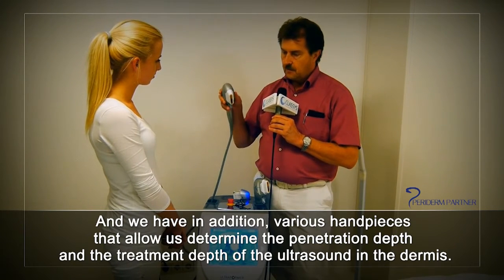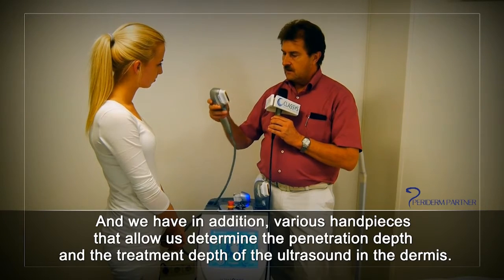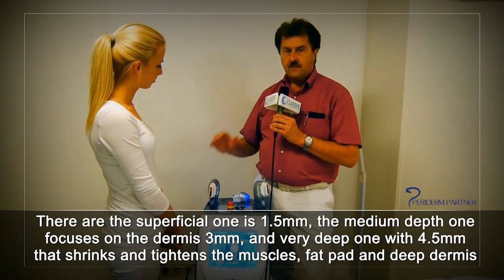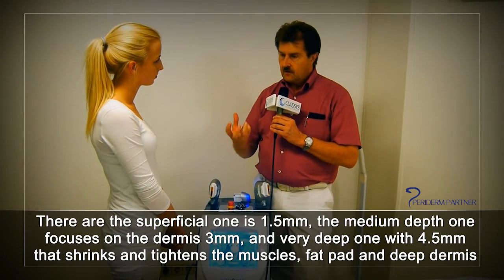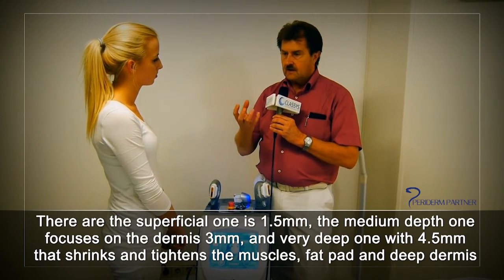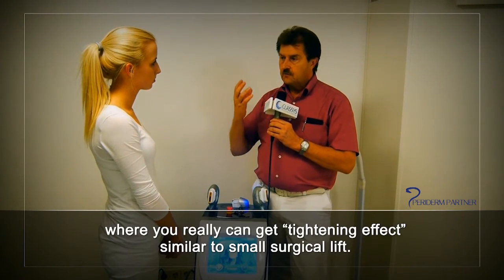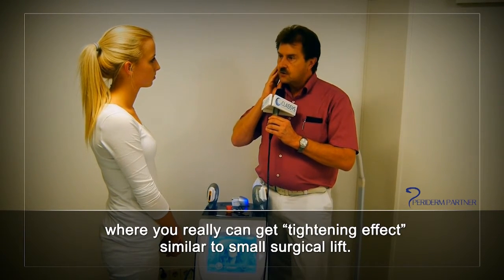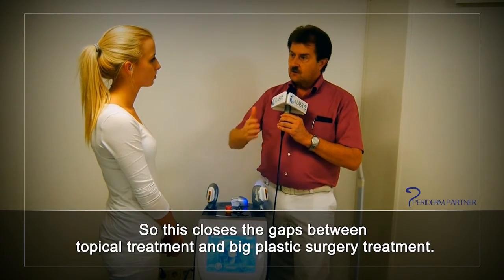We have various handpieces that allow us to determine the penetration depth and treatment depth of the ultrasound in the dermis. There is the superficial one at 1.5 millimeters, the medium depth one that focuses on the dermis at 3 millimeters, and the very deep one at 4.5 millimeters that shrinks and tightens the muscle, the fat pad, and the deep dermis where you can really get a tightening effect similar to a small surgical lift.